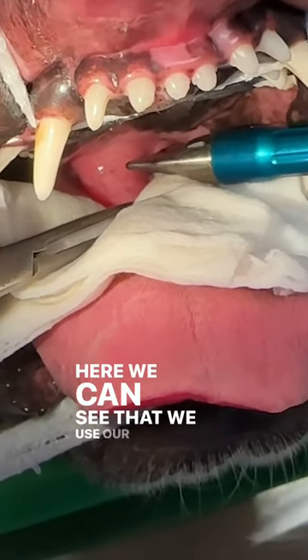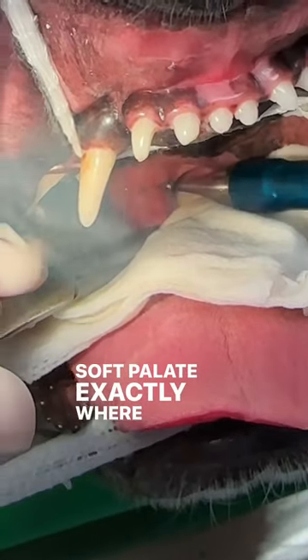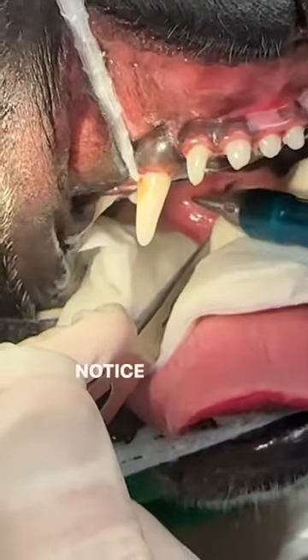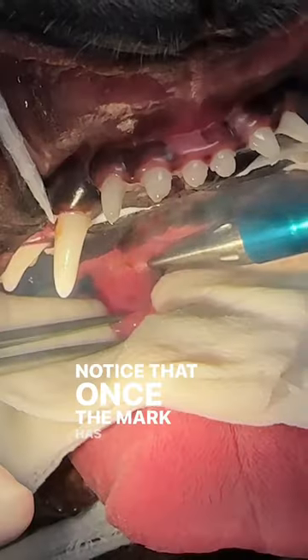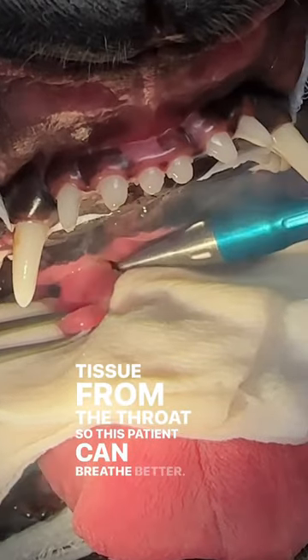Here we can see that we use our laser to mark the elongated soft palate exactly where we want to remove the excessive tissue. Notice that once the mark has been made, we then remove this tissue from the throat so this patient can breathe better.